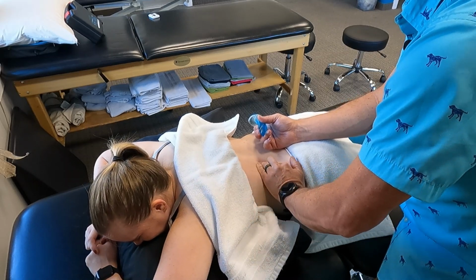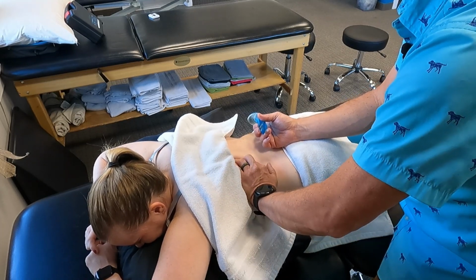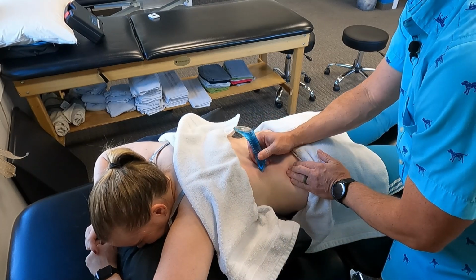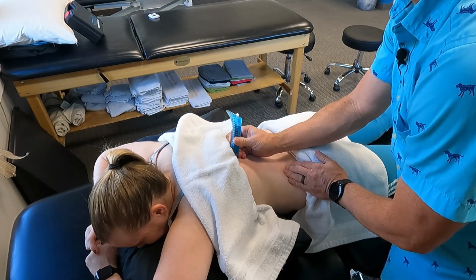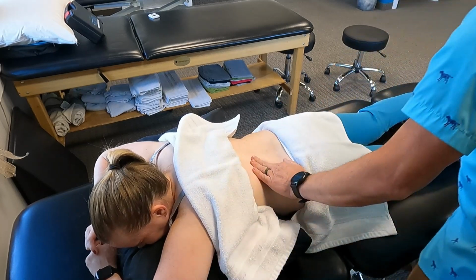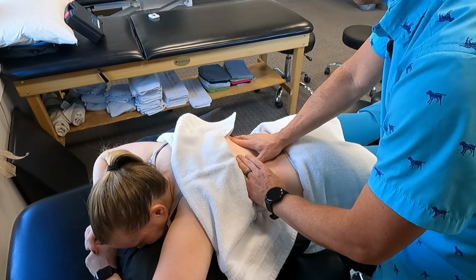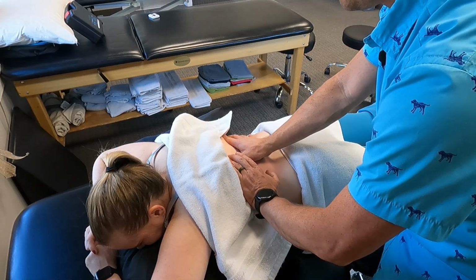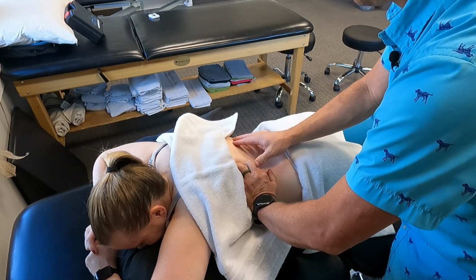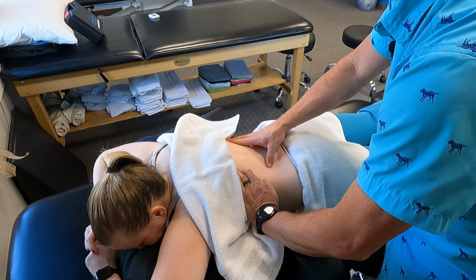But really, you're trying to feel for any of those muscles that are tight. They might feel tight on both sides, but these are the ones that kind of lock her down because of that concave side of her scoliosis. So I'll work deep into those with the tool, and then what I like to do after I work with the tool is I like to just get my fingers in there and just loosen that up as much as we can, specifically right on that paraspinal. So we're trying to get more mobility through there.